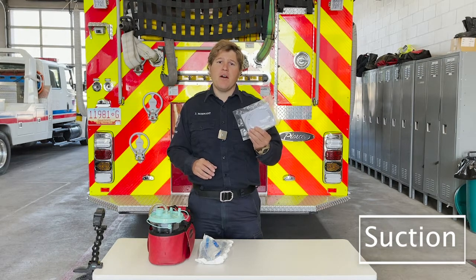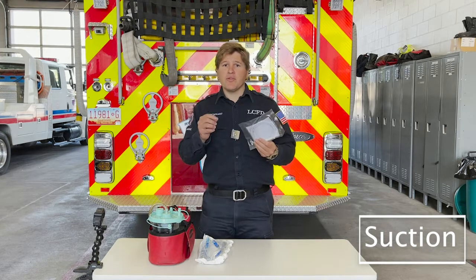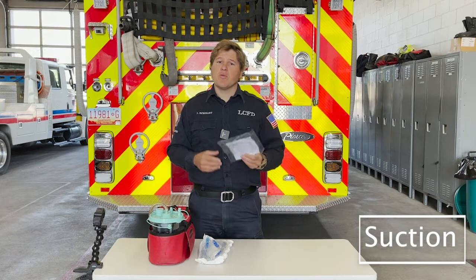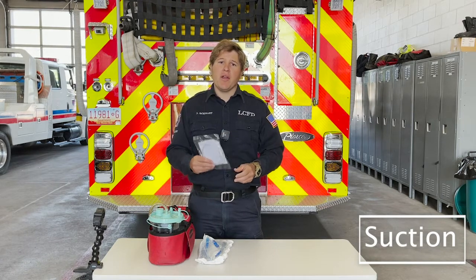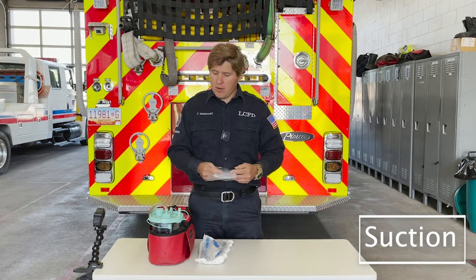Grab one of these that's appropriate for the size of the endotracheal tubes that can actually go down into it, but have this ready to go, because once we do perform that intubation, if we do need to suction out that airway, we have it ready. We don't have to look into a bag, and we can perform that.